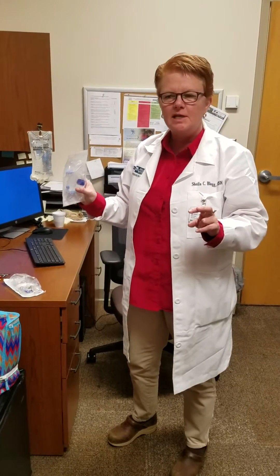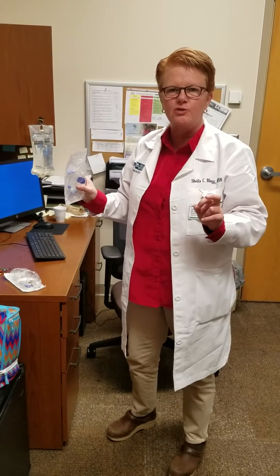Hello anesthesia providers. My name is Sheila Blogue, I'm the manager for quality. I'm going to show you a quick video on how to set up the dial-of-flow catheters in case you need to set them up for a critical medication transport.